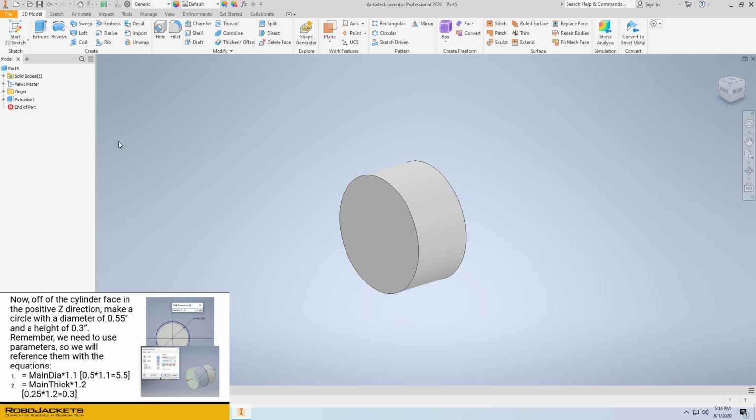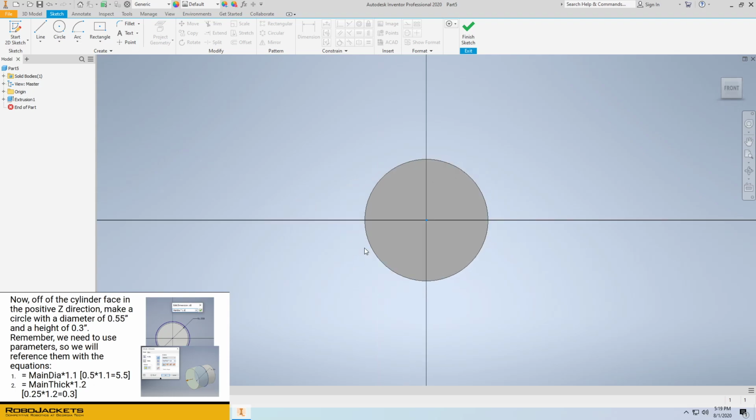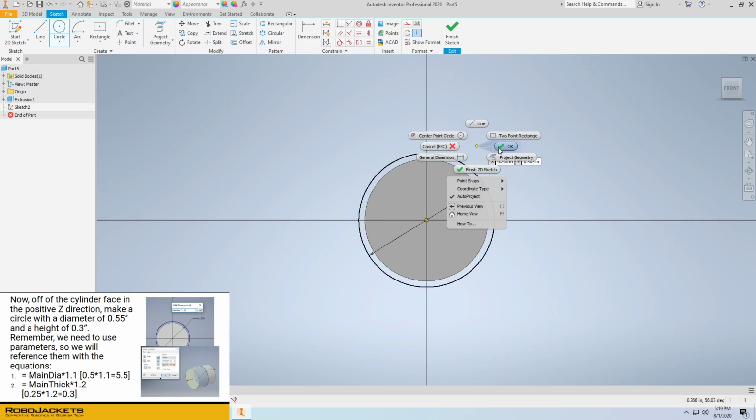Now this is where things will get a little hairy. First, make a new sketch off of the face of this part. We're going to create another circle, but we're not going to give it a definite value. Instead, it's going to be the main diameter's length times 1.1. There we go. This means that as we change main diameter, it not only changes the feature we made before, but it will also change this sketch.